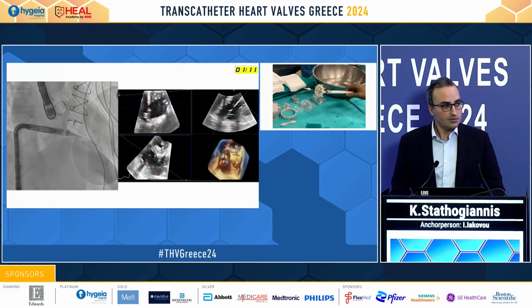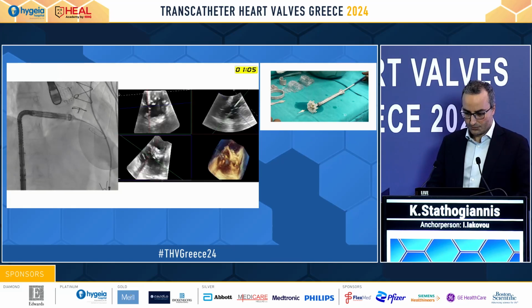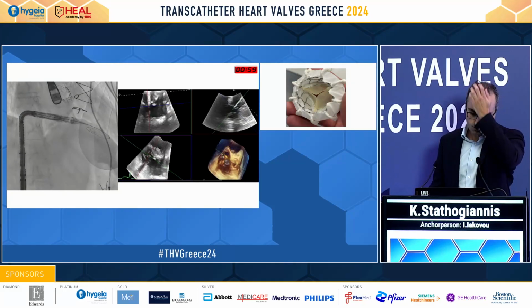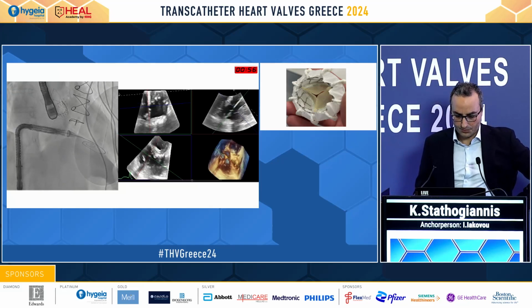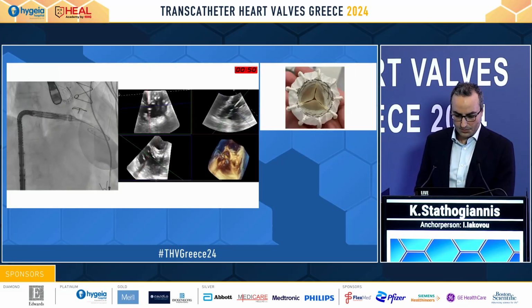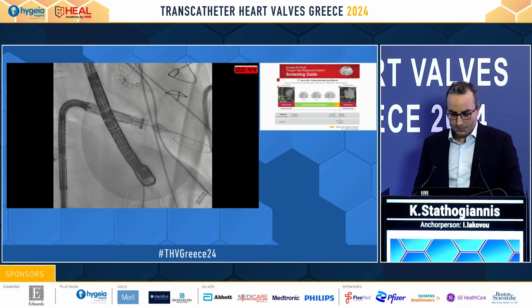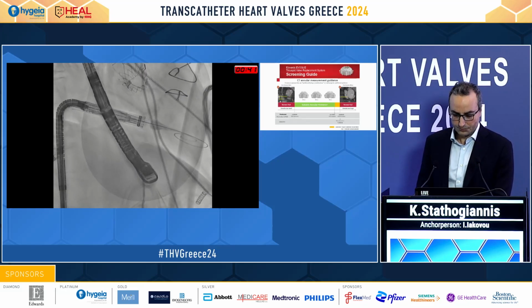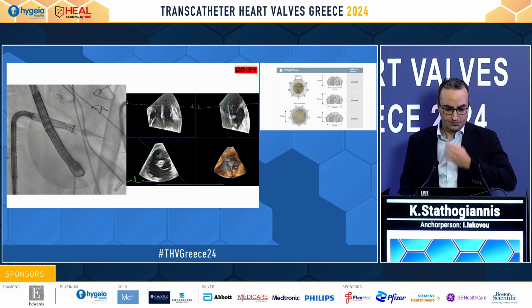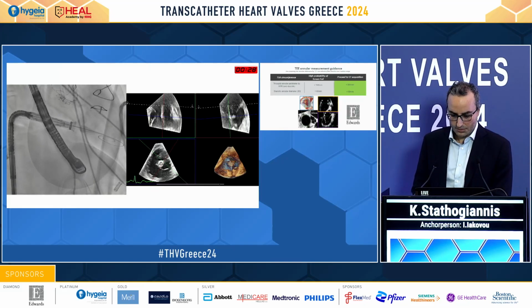And reconstructions from mid-esophageal view. The imaging is not great, actually. And I think most of the procedure we actually did with transgastric 3D imaging and multiplanar reconstructions from a transgastric position, if I remember well. But the quality of the images is not as good as we would like it to be at this stage. It's acceptable, but not perfect. And so we see now we've moved into this transgastric view in order to reconstruct from a 3-dimensional image all of the necessary planes that we need. And with that, we're actually able to do it very well.